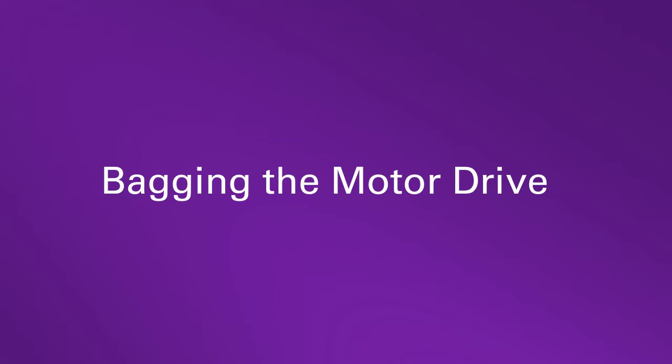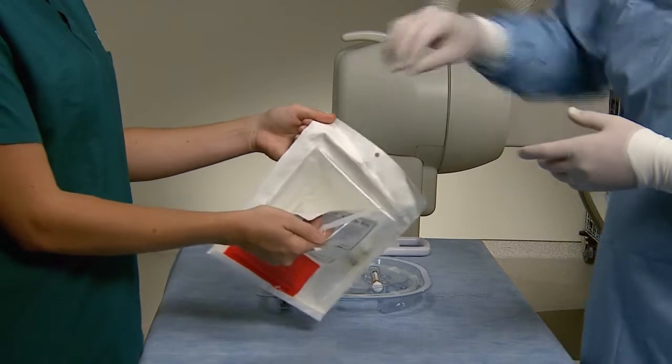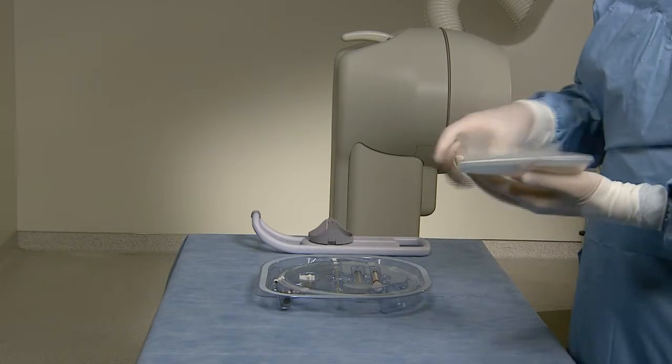Located inside the OptiCross imaging catheter box is the sterile bag. Bagging the motor drive unit requires two operators — one inside and one outside the sterile field. The non-sterile operator opens the pouch containing the bag and hands it off to the sterile operator.